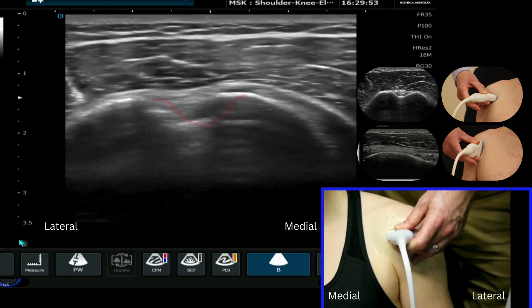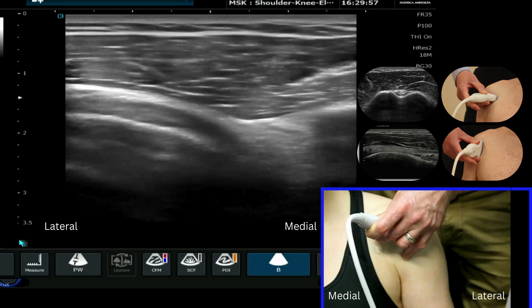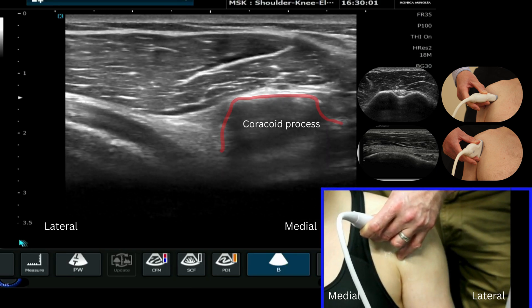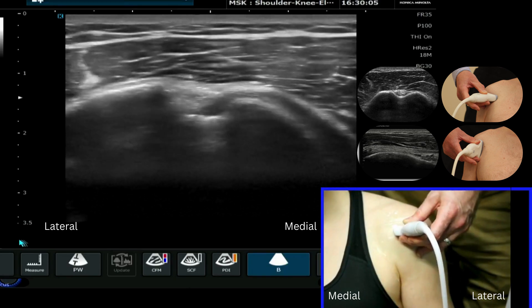If I move my probe medially we'll come across subscapularis, and if I keep traveling across we see the coracoid process. I'm going to move my probe back into my starting position.